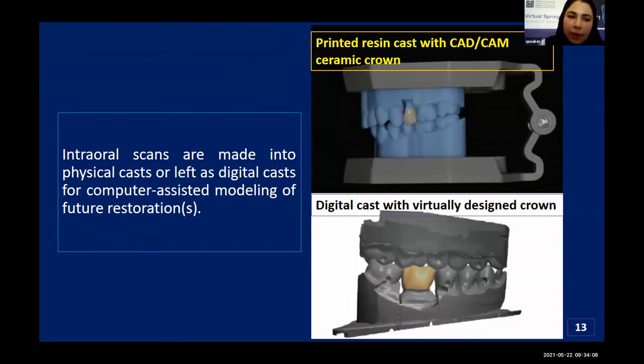So it's obvious that intraoral scans are made into physical casts like the picture on the upper part of the slide, or intraoral scans are left as digital casts, as you can see on the lower part of this slide. So the products of digital technologies and digital impressions may be different.